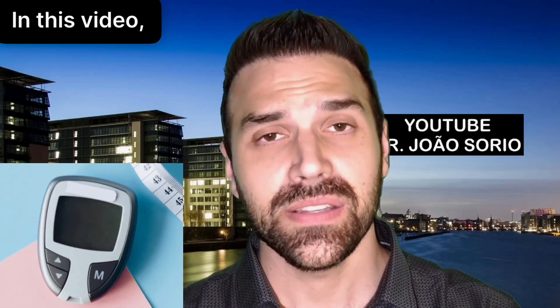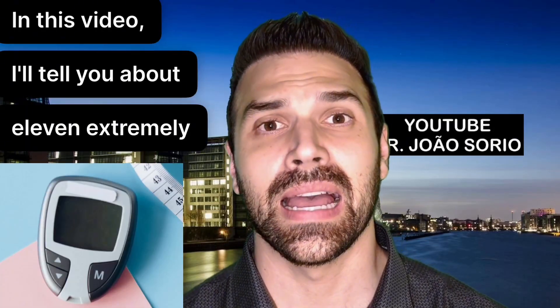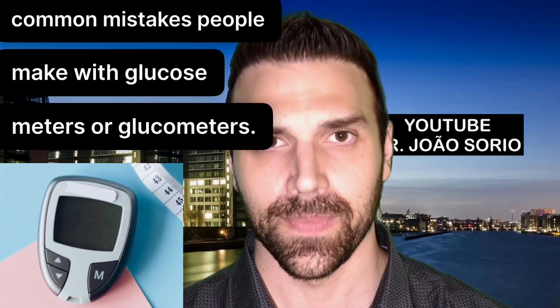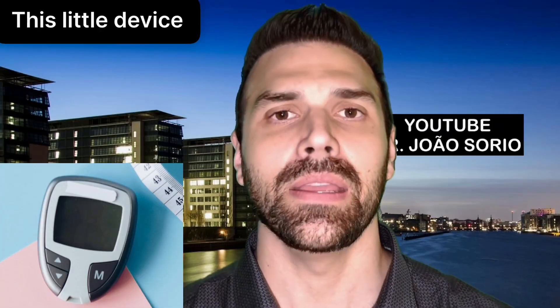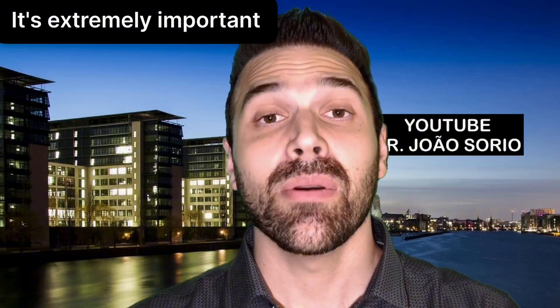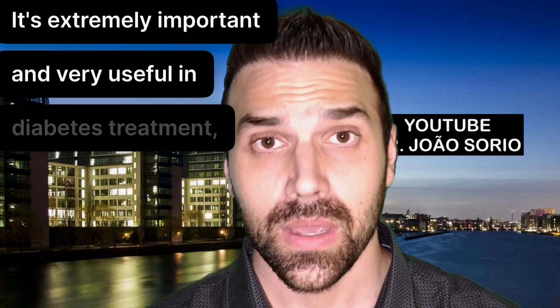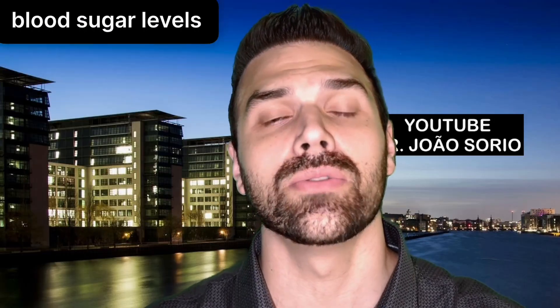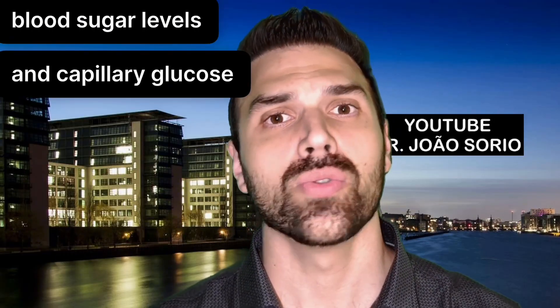You're doing this testing correctly. In this video, I'll tell you about 11 extremely common mistakes people make with glucose meters or glucometers. This little device you're seeing right now is extremely important and very useful in diabetes treatment for monitoring blood sugar levels, as it allows us to check blood sugar levels and capillary glucose levels.